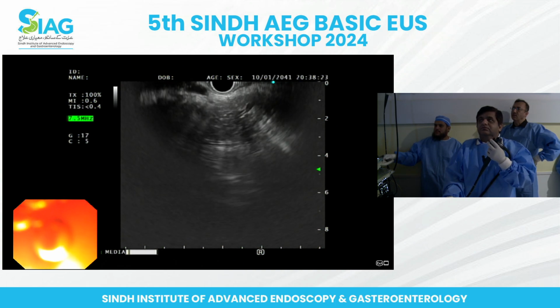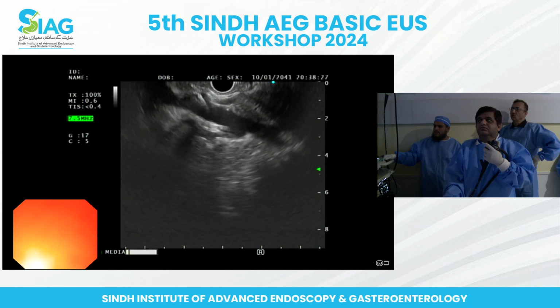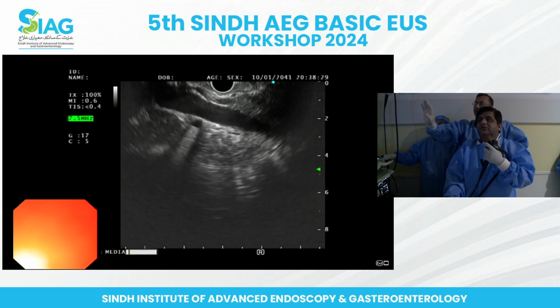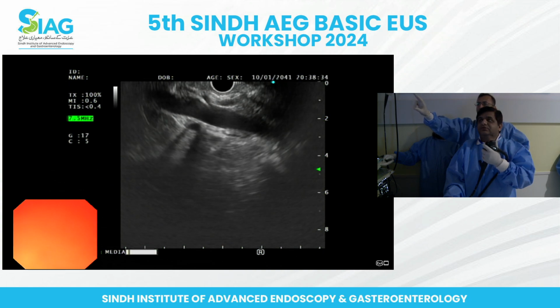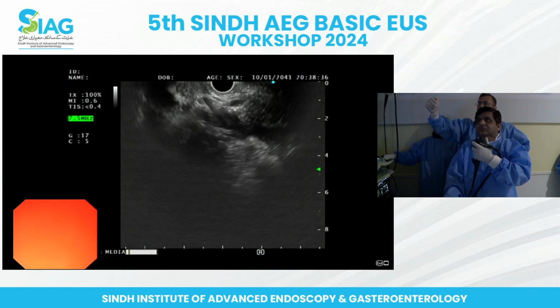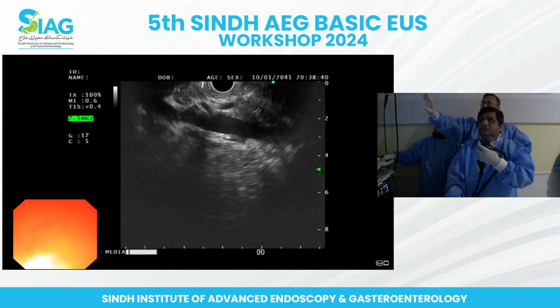Yeah, very good, shabash. Excellent. So, identify clearly. Now, this is portal vein. You need to show me the spleno-mesenteric vein. Big wheel up and slight rotation and pull back. Okay, now very good. Excellent.